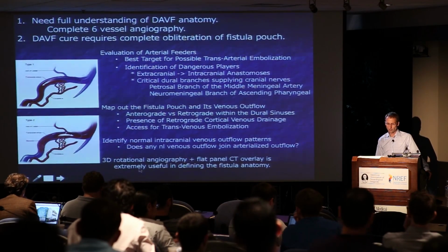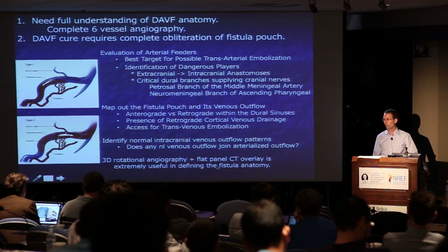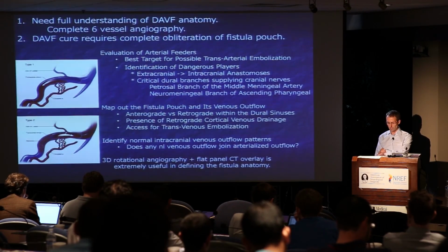I rely a lot on the 3D rotational angiography with the CT overlay to help figure that out. So sorry if I went over a little bit, and thanks for your attention.